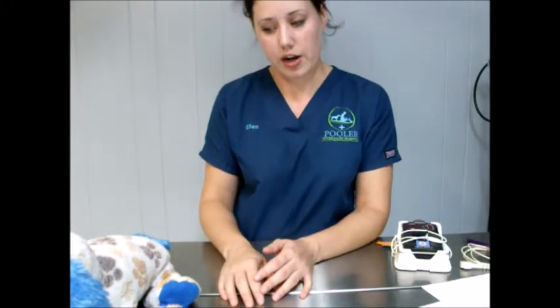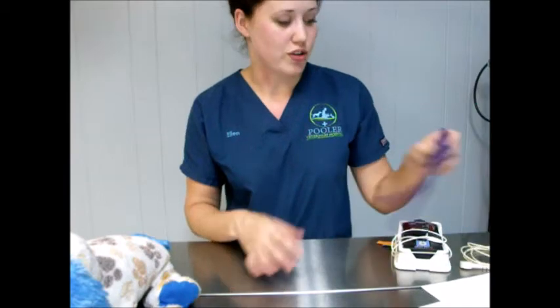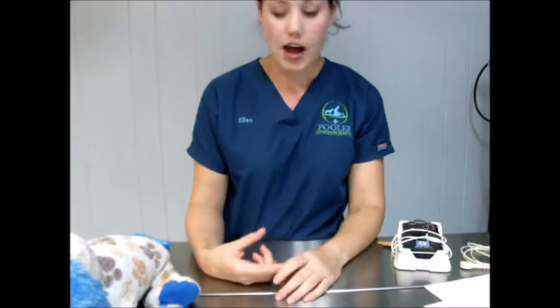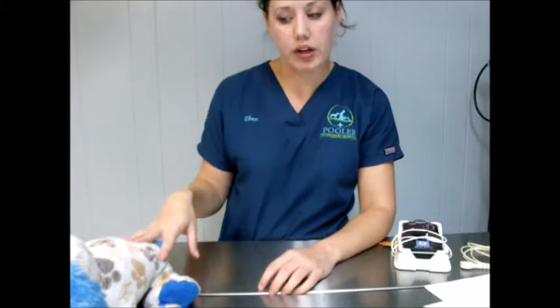It's an ultrasonic probe. We have one, but it is put away because they're very expensive. Generally, back in our surgeries, we use our cuff though. Of course, this lets you know about tissue perfusion. So same thing, making sure that the body is getting adequate blood flow throughout.